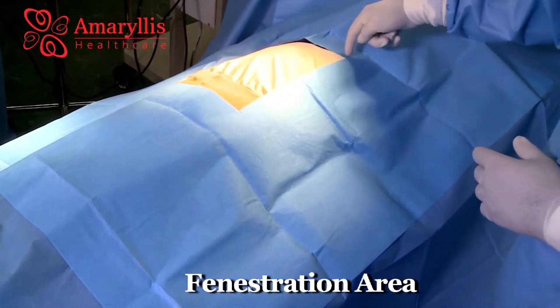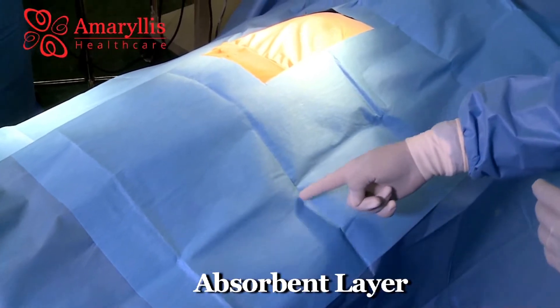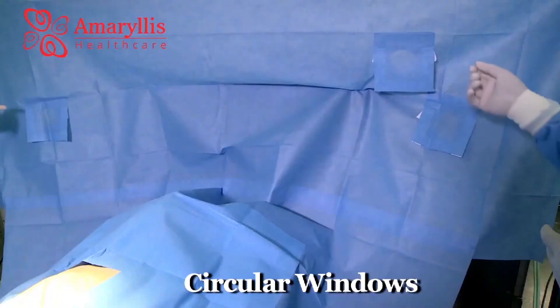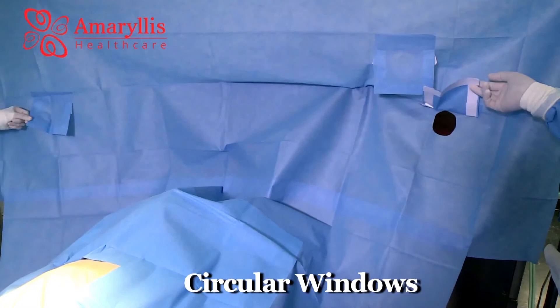An accurate fenestration area is provided to isolate the surgical site, and an additional absorbent layer is placed over the main drape to absorb blood loss during the procedure. Circular windows in the screen sheet allow for passing critical instrument tubes and wires.